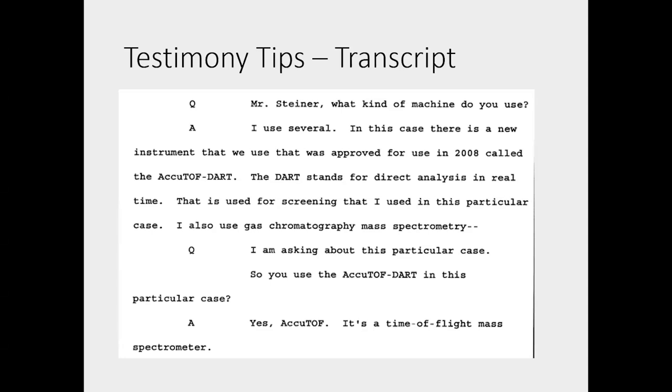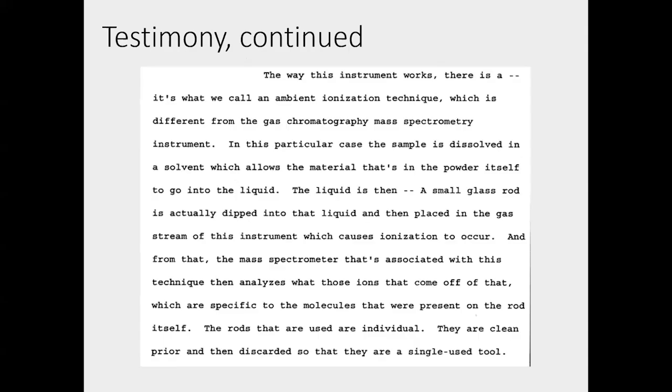So there was some follow-up saying, okay, so you used the TOF DART in this particular case. He said, yes, it's a time of flight mass spectrometer. Now, he did go into a little bit of detail on that. I won't read it all for you, but he does give a general overview. I like how he started with, the sample is dissolved in the solvent, which allows the material that's in the powder itself to go into the liquid.